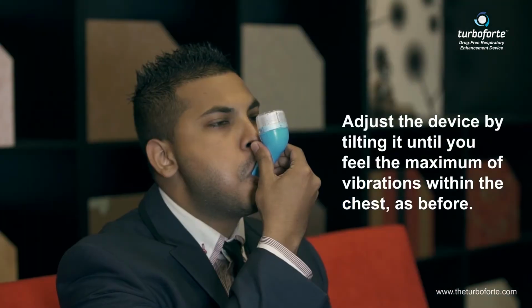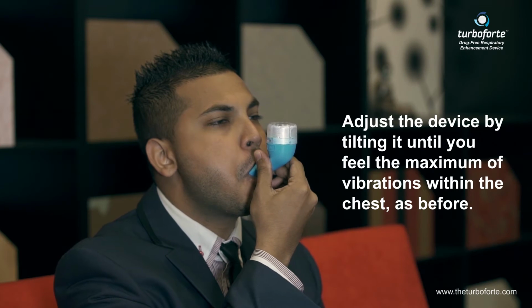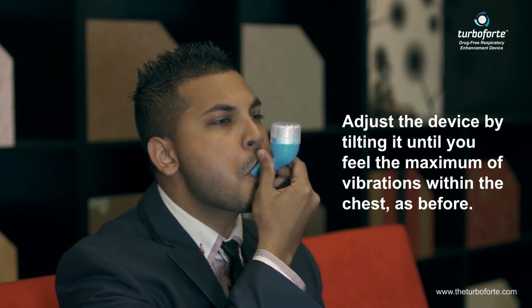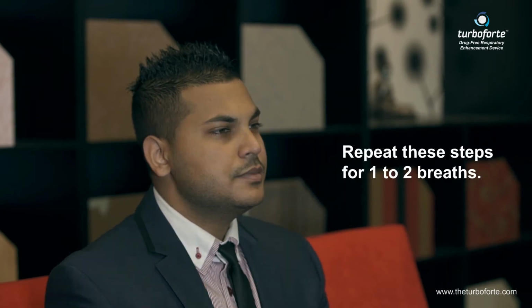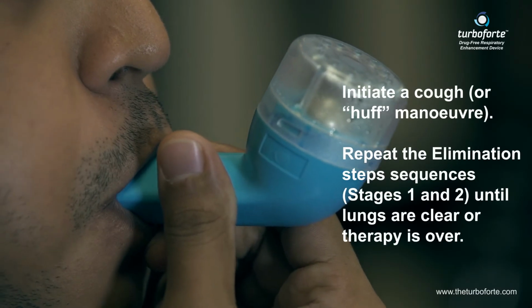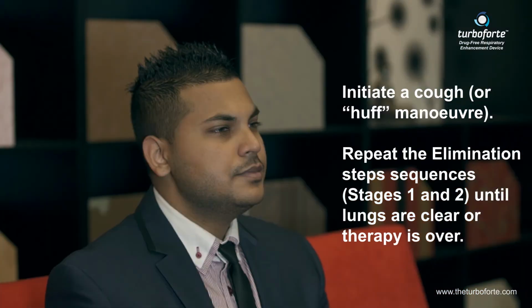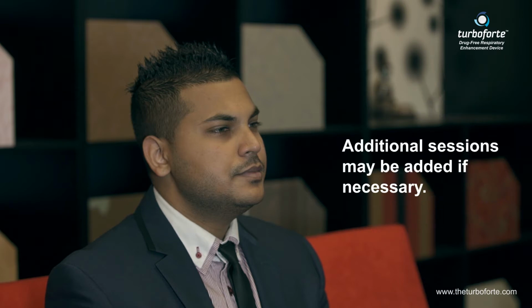4. Adjust the device by tilting it until you feel the maximum of vibrations within the chest as before. 5. Repeat these steps for 1 to 2 breaths. 6. Initiate a cough or huff maneuver. Repeat the elimination step sequences, stages 1 and 2, until lungs are clear or therapy is over. And 7. Additional sessions may be added if necessary.